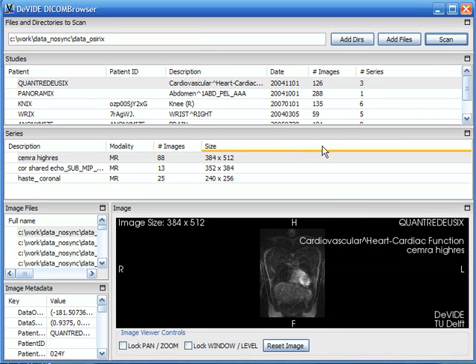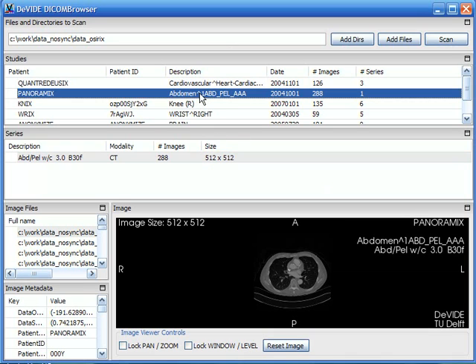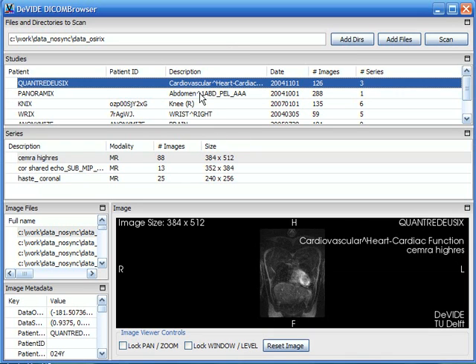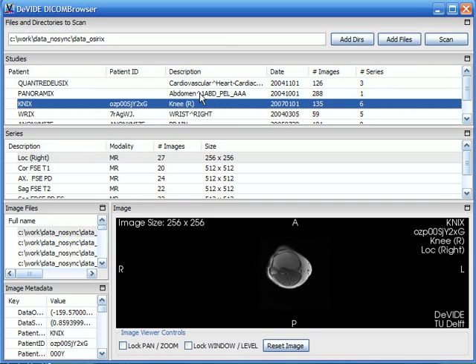It's in general quite quick and what DICOM browser does it goes and analyzes that complete directory hierarchy fishing out every single DCM file and analyzing it for the metadata and by using all of this it can collect together all of the various different studies and the series that are contained in your collection of files.